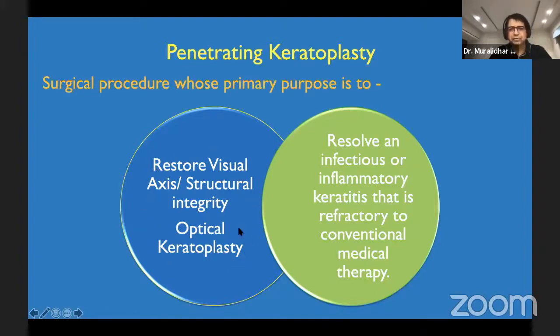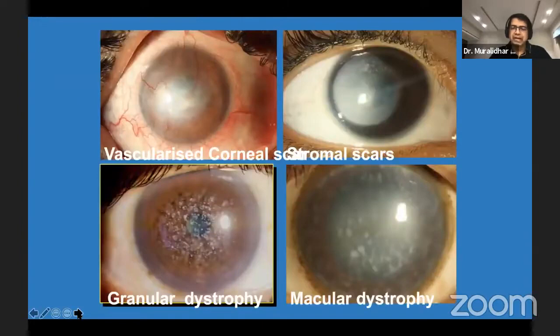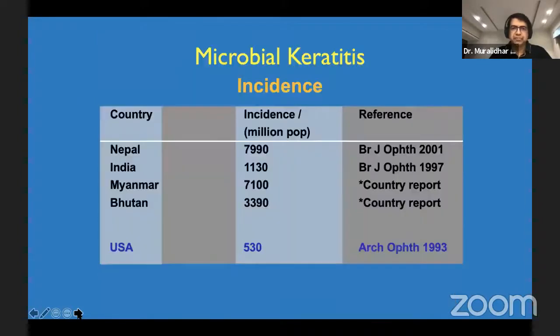You would typically use between 7.75 to 8.5 millimeters, depending on the overall corneal diameter. Whereas a therapeutic graft is mainly either for establishing a diagnosis or an eye-salvaging procedure. And you have a gamut of conditions wherein you may have to do a penetrating keratoplasty.